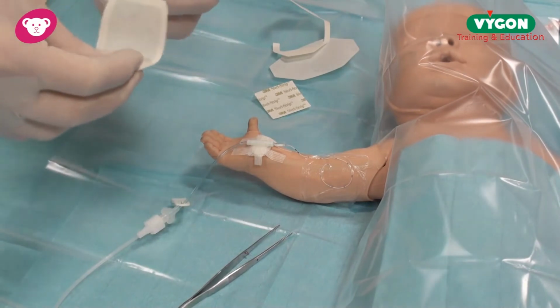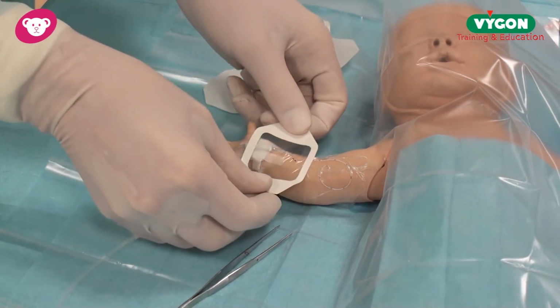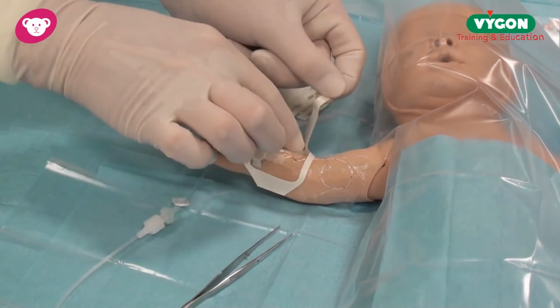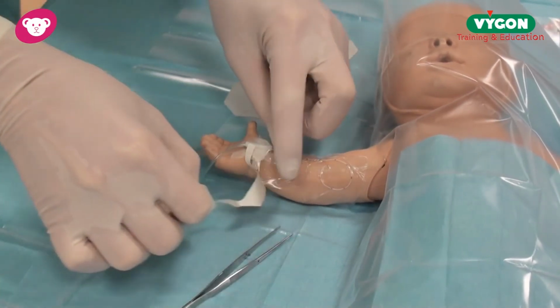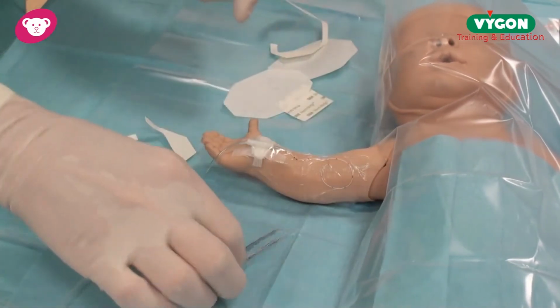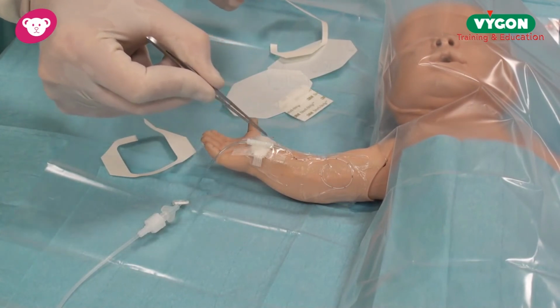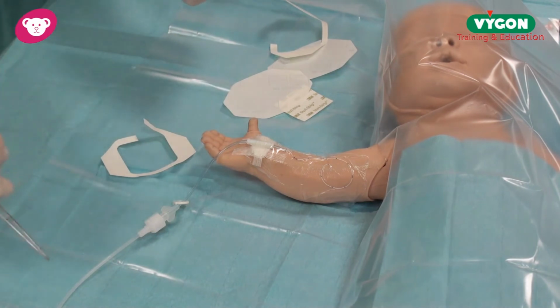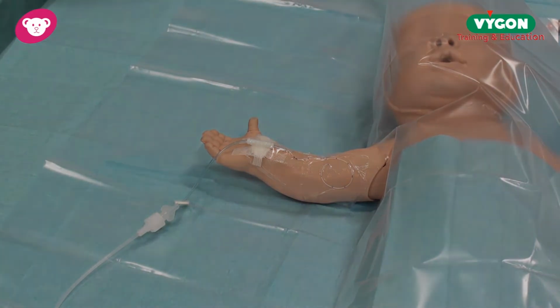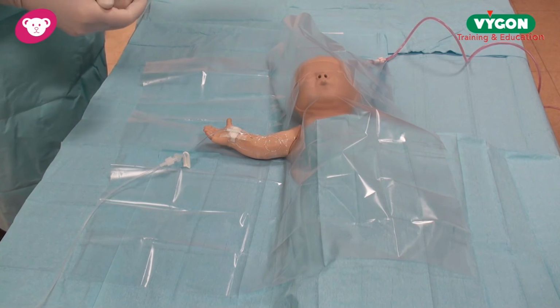What I'm going to do now is I'm going to put my final dressing over the top, like so. Remove the outer side of the Tegaderm. This is now complete. Please note the catheter is in a circular motion. There's no interruption with the catheter, and this catheter is connected to a syringe driver delivering saline to keep the catheter patent. We've now completed the PICC placement.